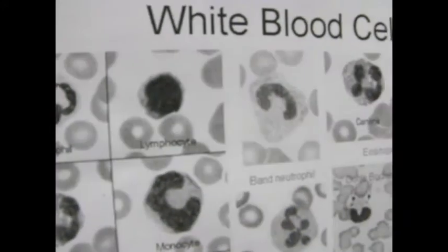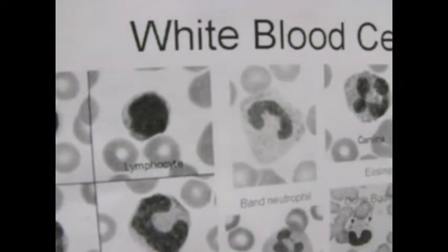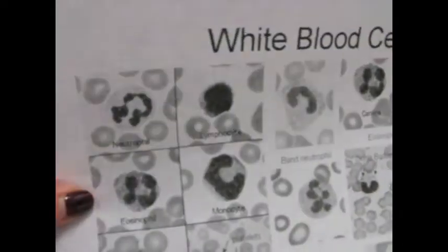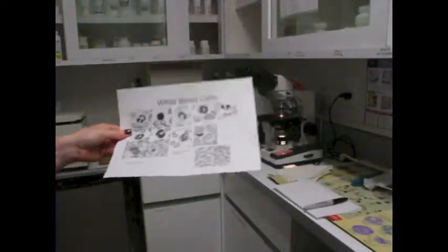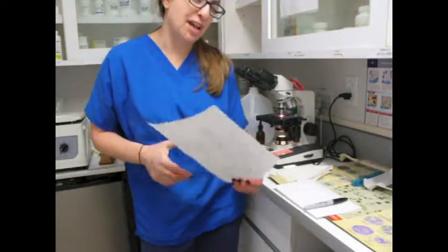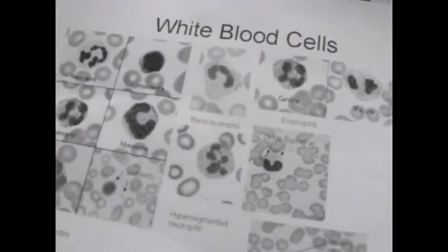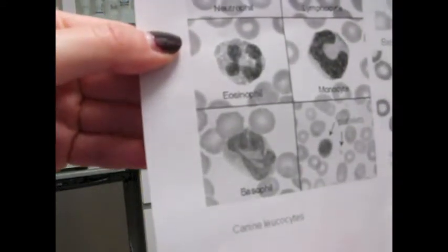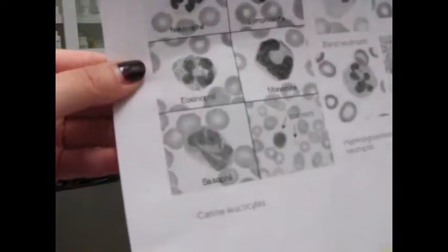So there's also the lymphocytes, which have a large nucleus. They have a small amount of blue cytoplasm. They are not as common as the neutrophils, of course, but they are often there. The eosinophils are actually very rare. So these stain usually pink or red, and you would rarely see them on a slide. So I probably will not see any on this slide. Next we have the basophils, which look like that. They are also rare, probably will also not see any on this slide, and they usually stain blue-black with the stain, so they have a somewhat different look.